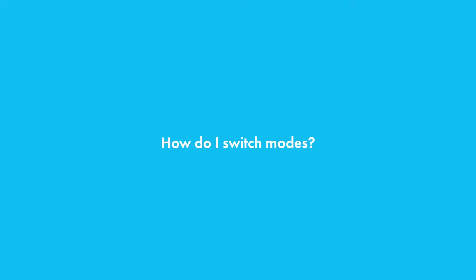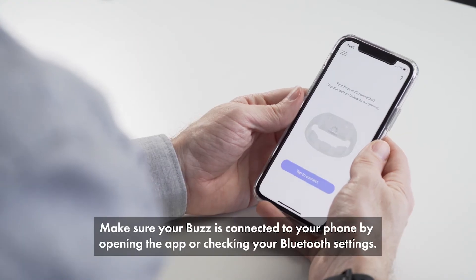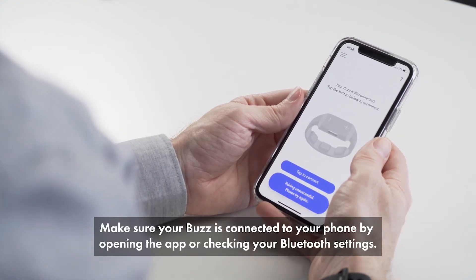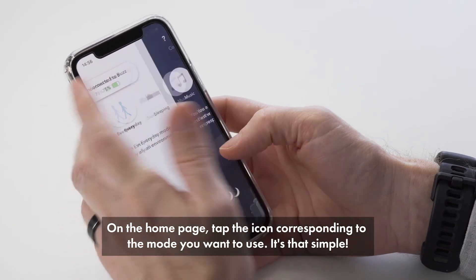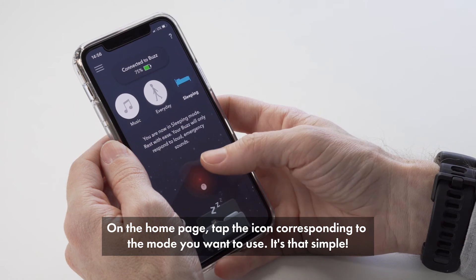How do I switch modes? Make sure your Buzz is connected to your phone by opening the app or checking your Bluetooth settings. On the home page, tap the icon corresponding to the mode you want to use. It's that simple.